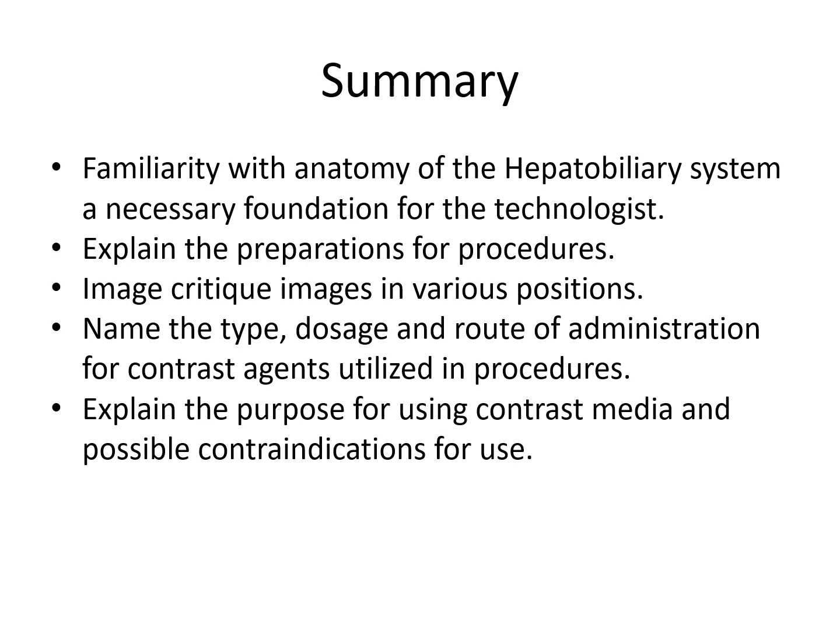Remember I said the route of administration varies according to each procedure type, but the type and the dosage are pretty similar. It's about 15 to 20 cc's of iodine contrast, non-ionic, for biliary systems.